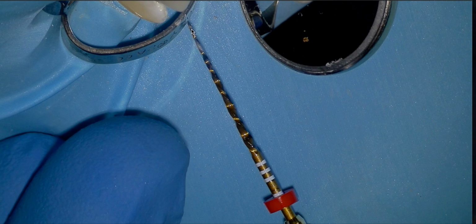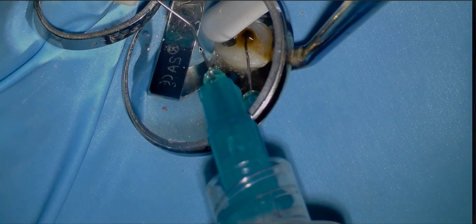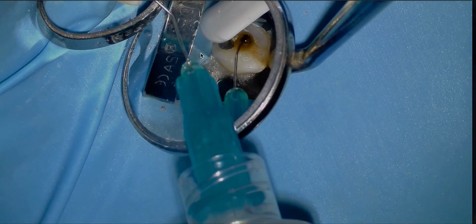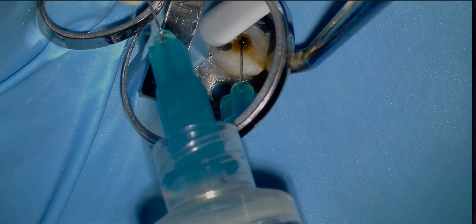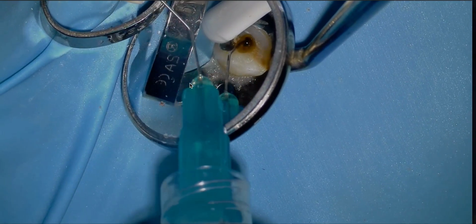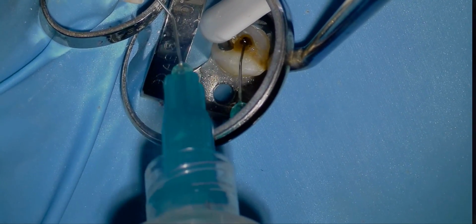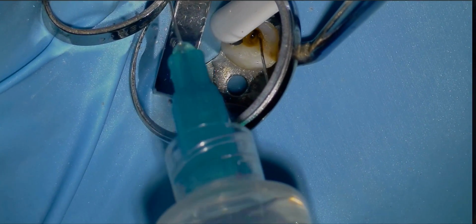Then we check for debris, and we're going to continue down the road of lots of irrigation. So now we've bypassed that block. There's not really much to bypass, but we've gotten through it. That's probably the better way to talk about it. We've gotten through the block using this simple 6-8-10 technique. We've established our glide path, and now we're going to continue with our life and get this root canal over with.